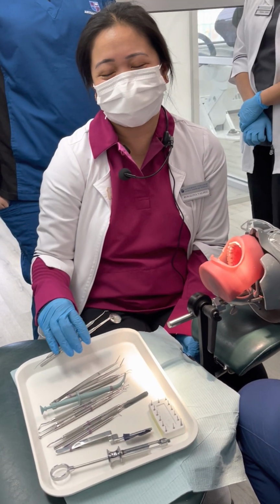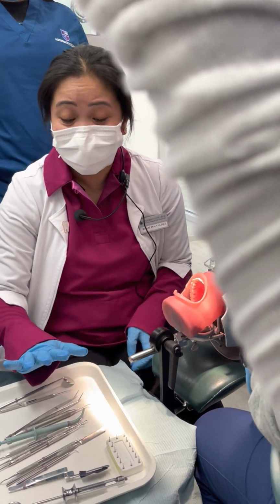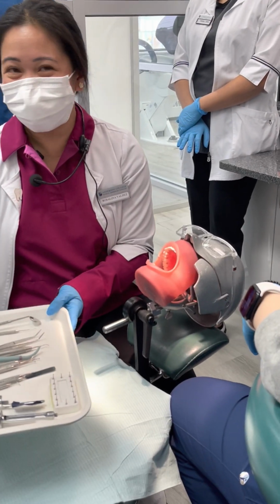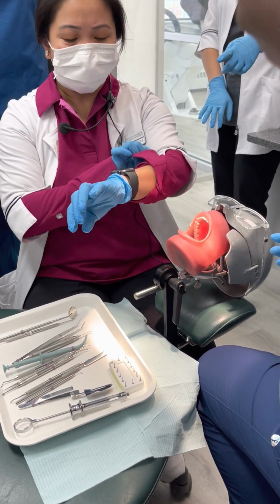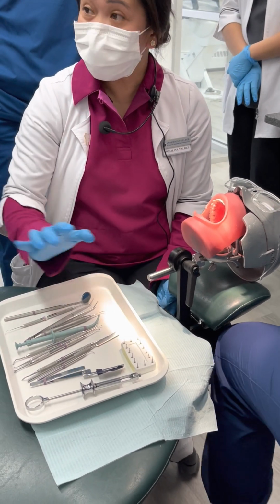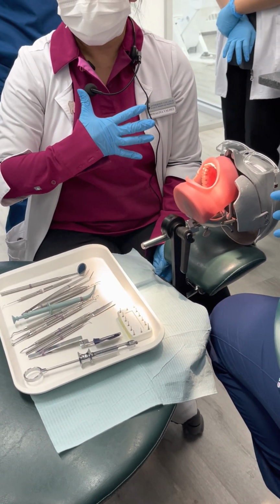Do not put it on the patient's chest, please. I just put it in here so you can see, but do not put it on the chest of the patient. Understand? There's a tray.